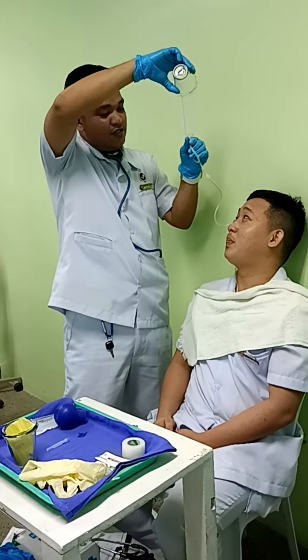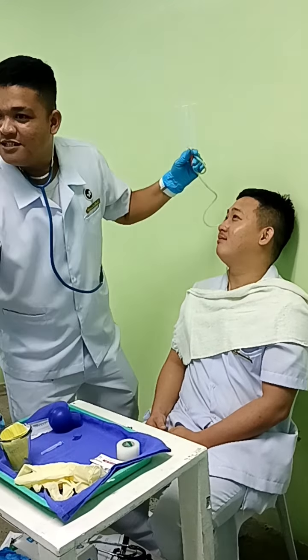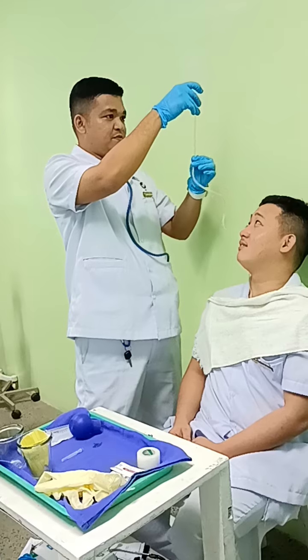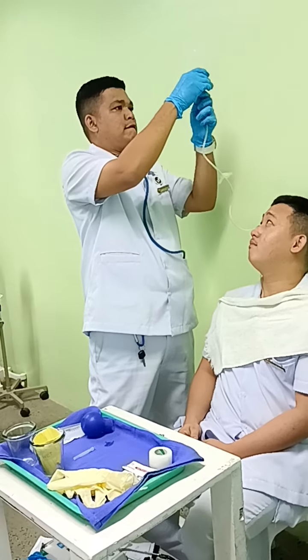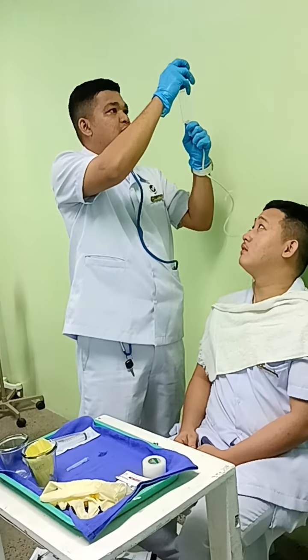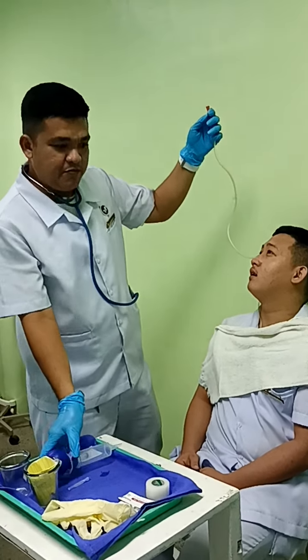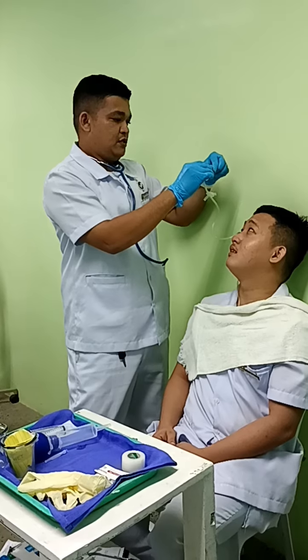Sir, just signal me if you feel any discomfort. So gently. For the next procedure, we have to clip or cap this one to avoid cross-contamination.